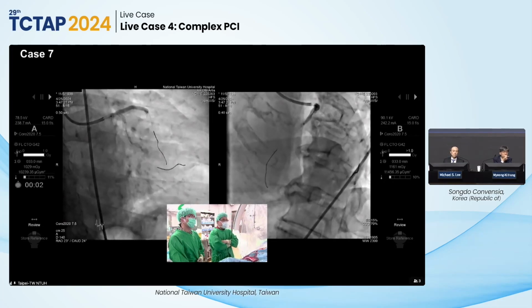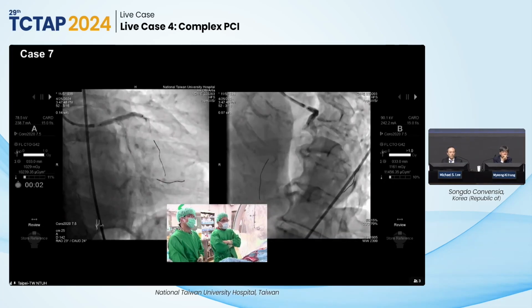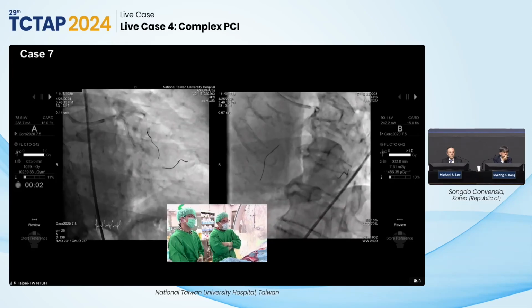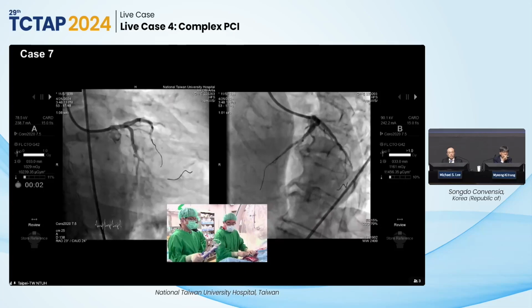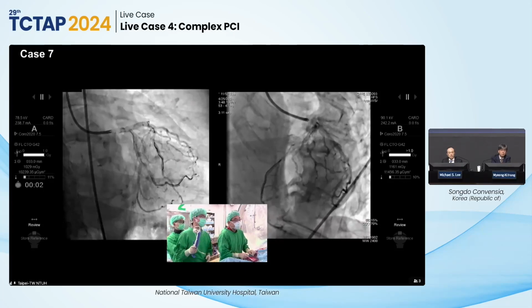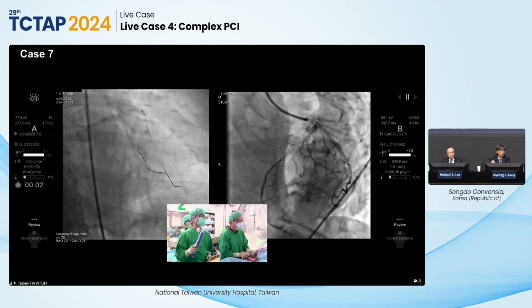Next. Again, stent balloon part. Next. And we switch the wire. This is the result. So we are at the point of sending both balloons inside for the KBT. So far, very excellent result.